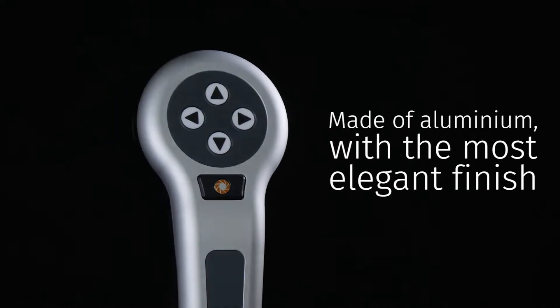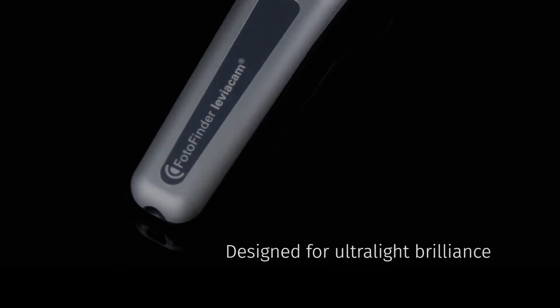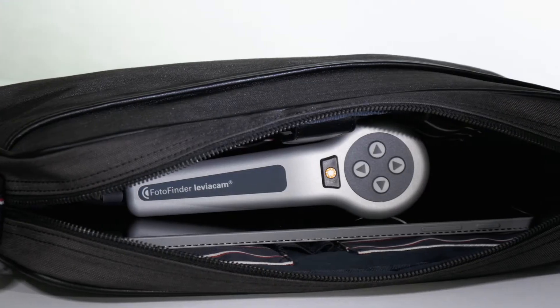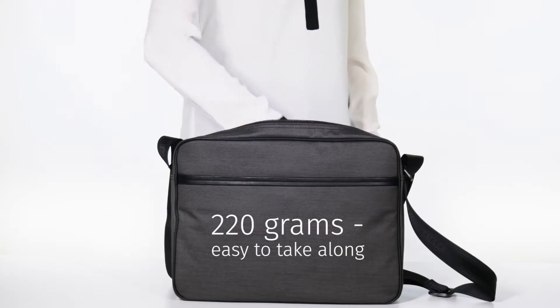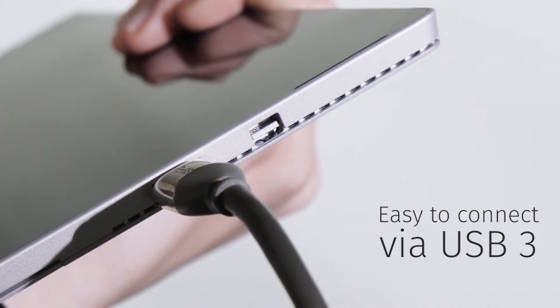The camera body is made of aluminium with the most elegant finish. Leviacam was designed for ultralight brilliance and thermoscopy. At 220 grams, you can take it with you anywhere you go and easily connect via USB 3.